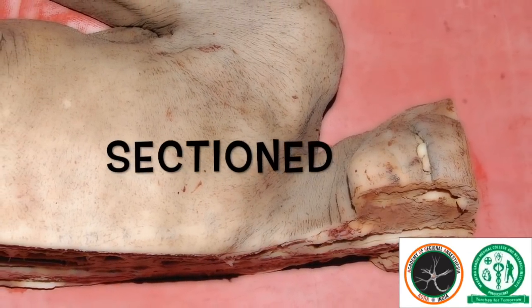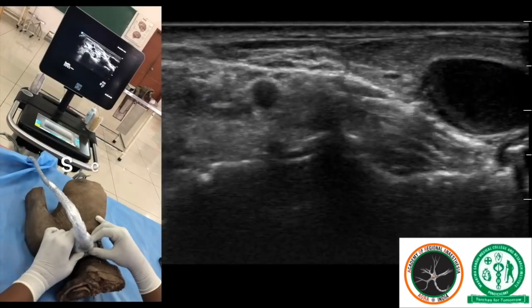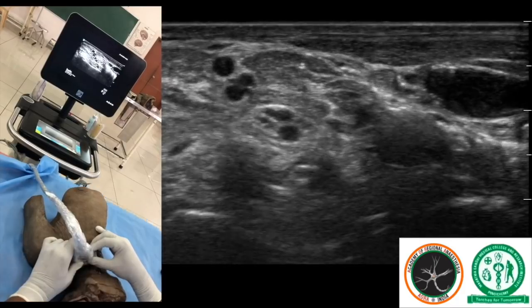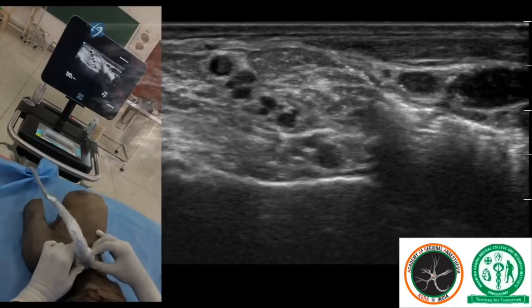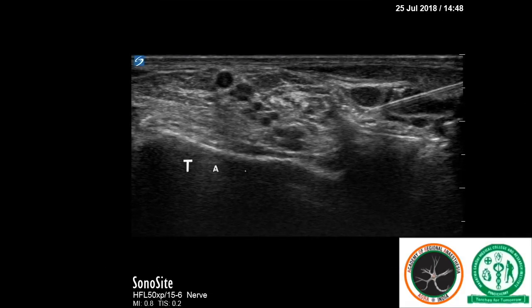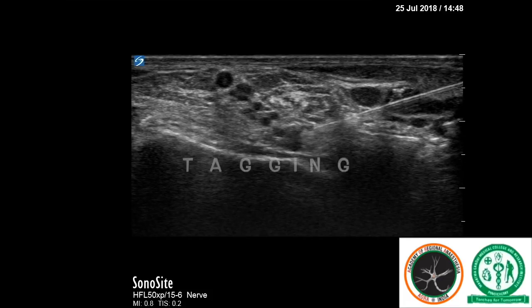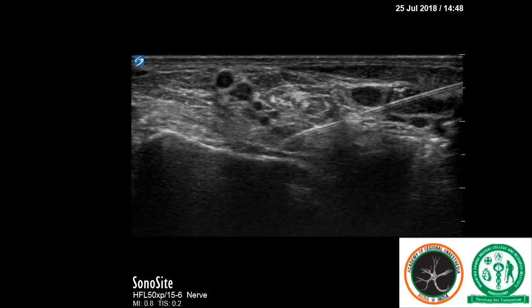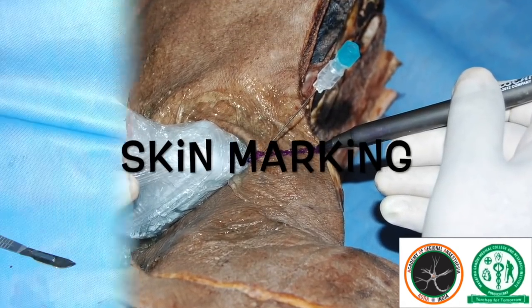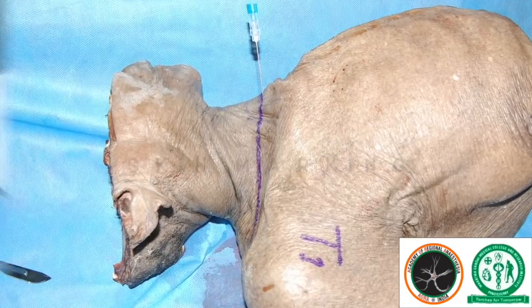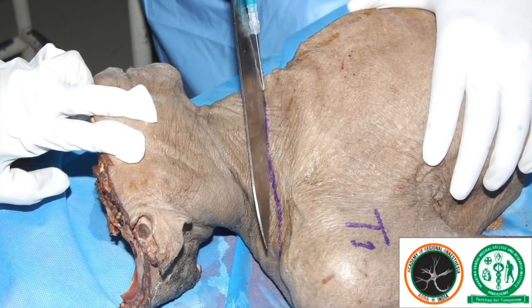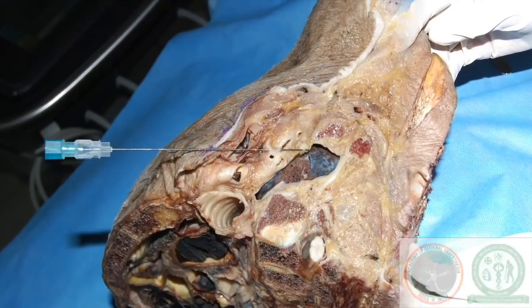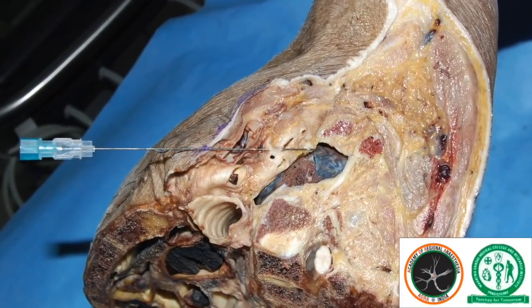First, the cadaver was sectioned. Then it was scanned with the ultrasound to identify the brachial plexus elements. These elements were then individually tagged, and then the skin was marked along the same plane. With a knife, we sliced exactly along that plane, and with this we hoped to achieve actual anatomy cuts as we see on the sonoanatomy.